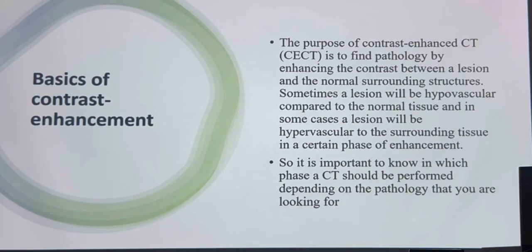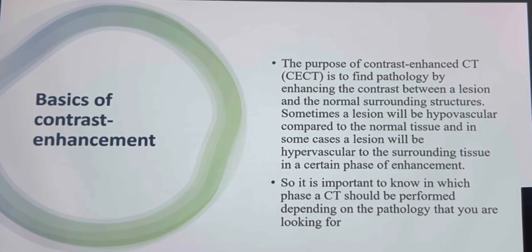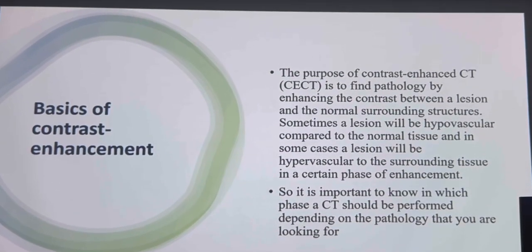Let's focus on the liver and pancreas. This structure is present in our body. There is evidence of a lesion we are looking for, to see, to diagnose, to document. The job of the contrast is to make a difference in grade or attenuation between the organ and the lesion. This is what we are aiming for.